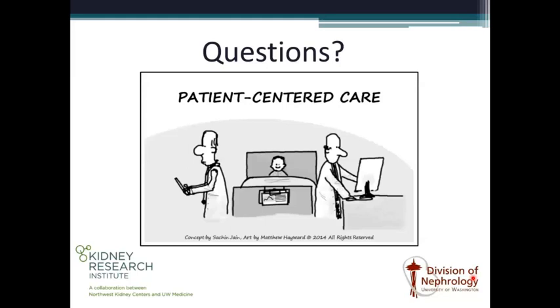Yeah. So it's an oscillometric device, just like your clinic blood pressure devices. It's just very small, and they've been calibrated and validated against international standards, and so you get good blood pressures. However often your doctor sets it for, which if they're cruel is every 15 minutes and otherwise is every 60 minutes. Yeah, so it does go off every 15 minutes.